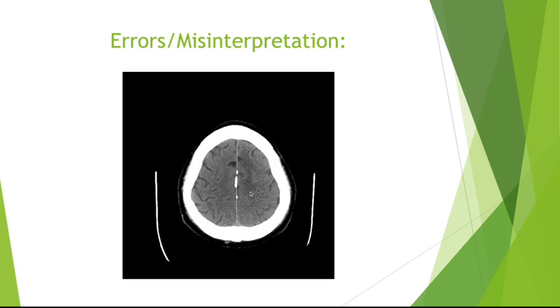Similarly, in this particular patient, there is an anterior cerebral artery territory infarction. However, the aspect score mentioned by the software was 10 because the aspect score is heavily biased towards MCA strokes. ACA strokes do not make up the aspect score, and so this is the reason why the Brainomix software sometimes ignores areas of hypodensity in the ACA territory.